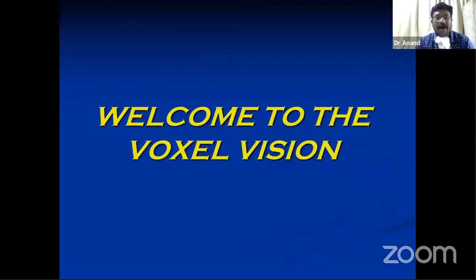So with that note, I welcome you all to the voxel vision, where we need to know about a three-dimensional image. With the basic disadvantages of two-dimensional imaging modality, the imaging modality that came into existence to see the spatial relationship of all the structures was a three-dimensional imaging modality. And the basic three-dimensional imaging modality was the CT. That was the initial invention.